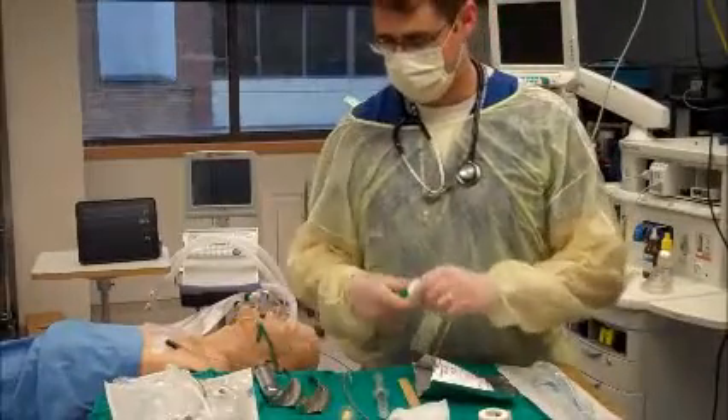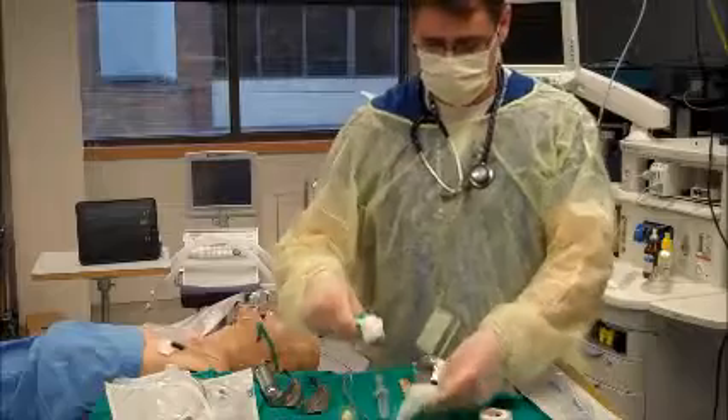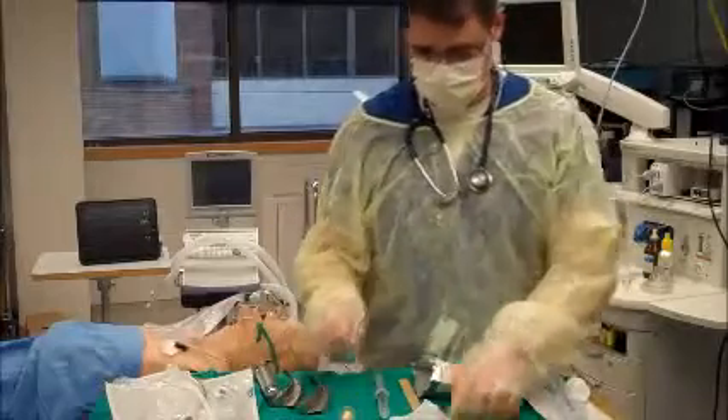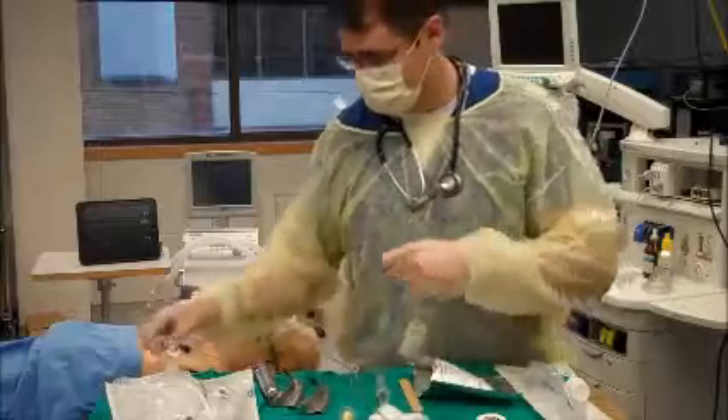What I'm going to do now is demonstrate an intubation. My patient is pre-oxygenating. I'm going to get a little bit of lube on some gauze here, and quickly get the stylet lubed up.